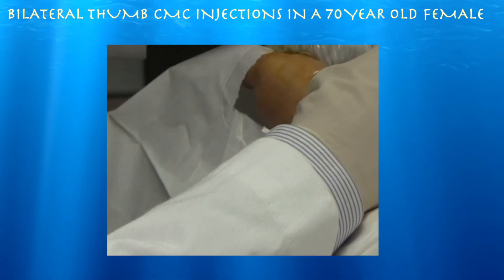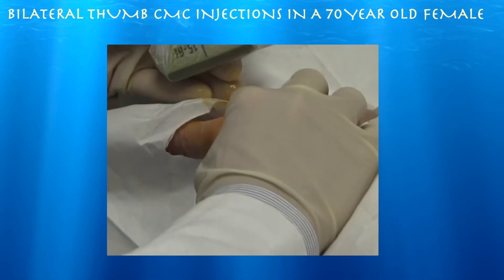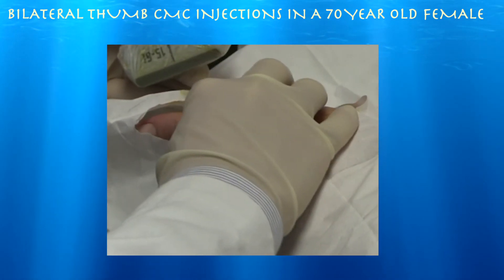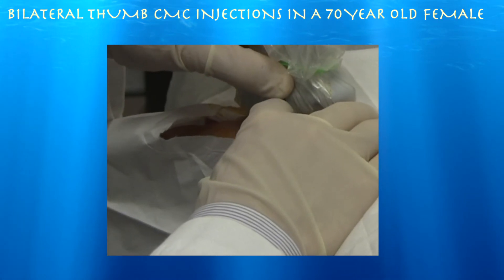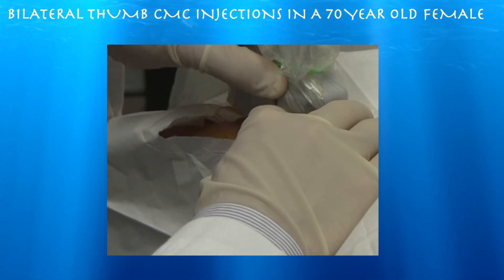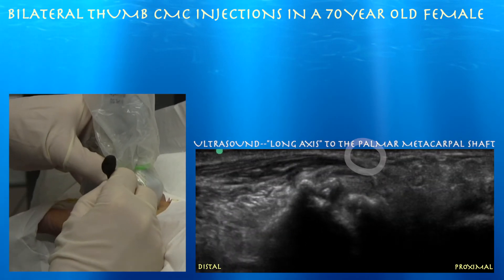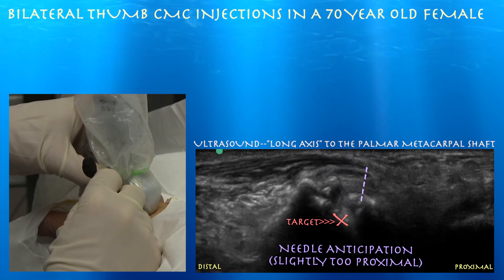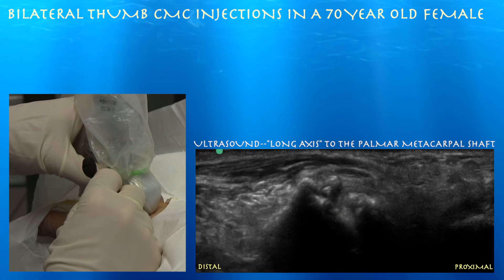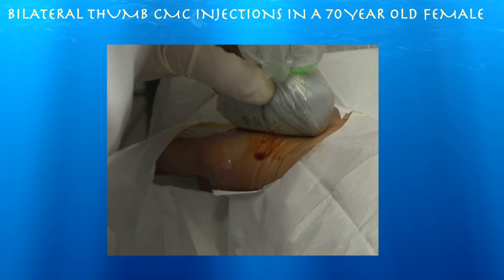We're going to use basically a volar radial type approach, right here. Here's our metacarpal, so it's right in this space. I'm going to go short axis to the needle because I don't think you're going to see much of a needle here. We're a little bit too proximal — we want to get between the two bones. So certainly you adjust for that when you plan your injection.